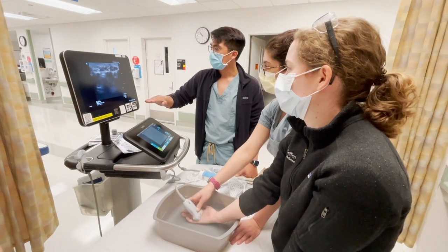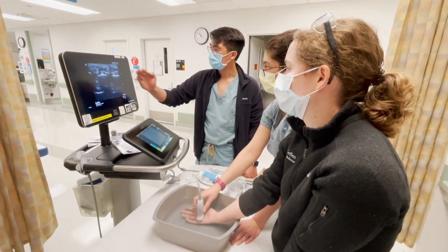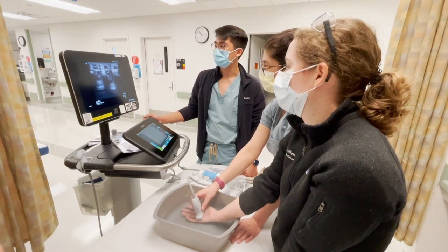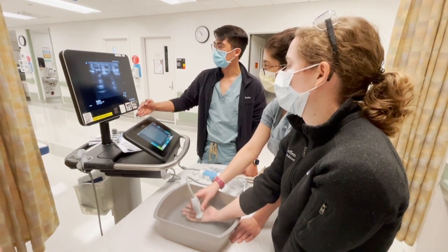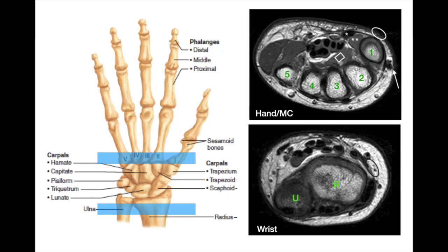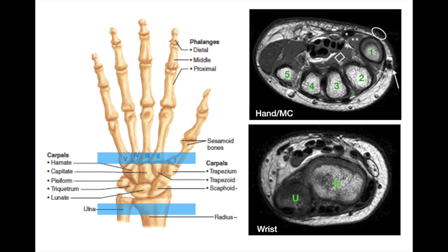Here we see the metacarpals and, more superficially above, are the flexor tendons. If we tilt the probe, they will come more into or out of focus — that's again the phenomenon of anisotropy; we want the angle to be nice and perpendicular to the flexor tendon. These are short axis or axial cuts of the hand and wrist on MRI, from the level of the distal radius and ulna to the carpal bones and to the beginning of the metacarpal bones.